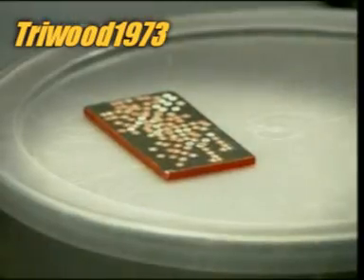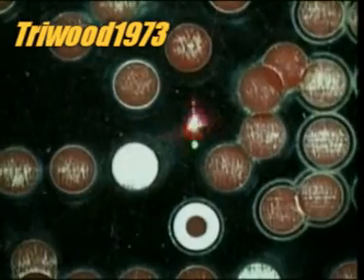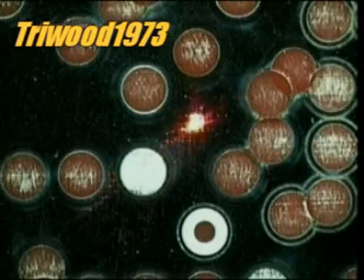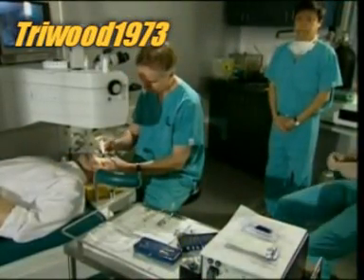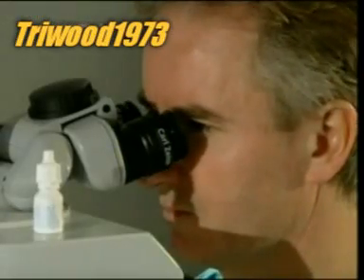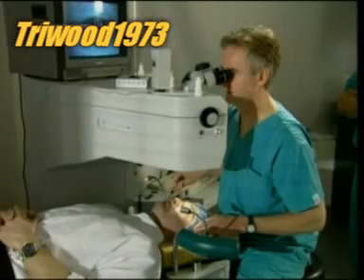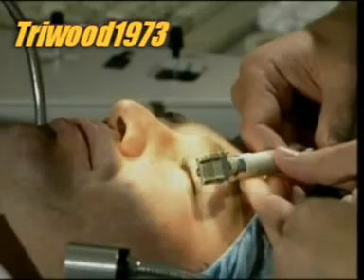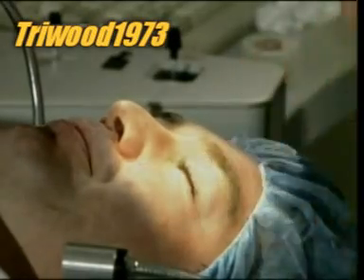Next are antibiotic drops which prevent infection. Before every operation the surgeon tests the equipment. He fires the laser on a metal plate to test its energy level. The surgeon administers a few more anaesthetic drops, then inspects the microkeratome, the device used to lift a very thin layer from the outer surface of the eye. The patient's cornea is measured using an ultrasonic instrument.